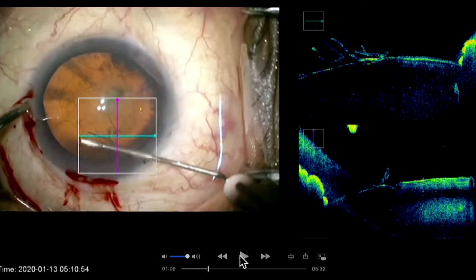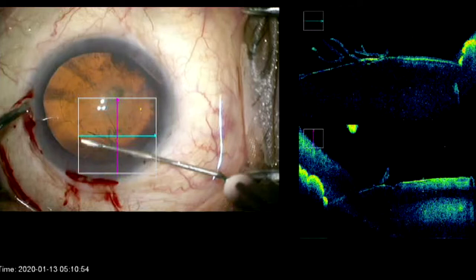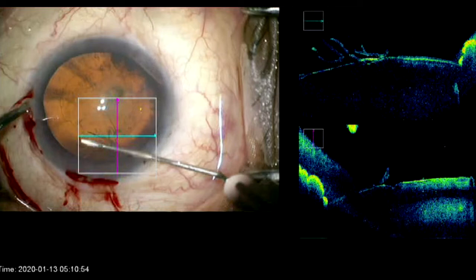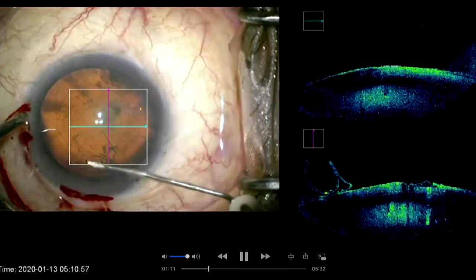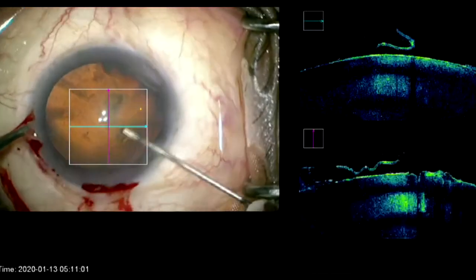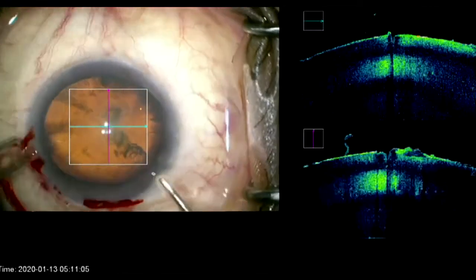This is the completion of the capsulorrhexis. You can see the initiation and the capsule being picked up. Most importantly, there is no disturbance of the cortex — that is very important. When doing capsulorrhexis, make sure your cortex is not disturbed. If your cortex is disrupted, axis visibility is poor and the rhexis can be difficult. In that situation, if you are a beginner, it's always better to put a dye on the anterior capsule, even if you have a good red reflex. With dye injected you can see the capsule during capsulorrhexis and during nucleus manipulation. I recommend young surgeons to always stay within the capsule. Even in hazy corneas you can use OCT to pick up the rhexis edge. This is a central circular capsulorrhexis of approximately 5 millimeters in size.